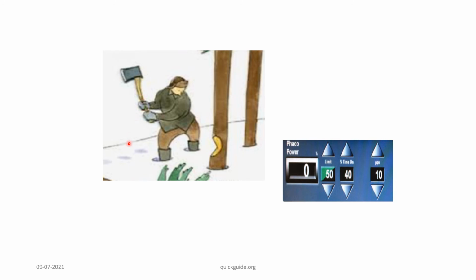So as you can understand from this real world example, it is a combination of all these that will efficiently deliver energy inside the eye. If one of these components is just too big or too small compared to the others, it will not bring the desired result. So the distance that the cutter travels, the time that he takes to rest, as well as the number of times that he hits, will always have to be in synchrony so that energy can be delivered in a well-mannered fashion inside the eye, so that in the least amount of time the nucleus can be broken and emulsified.